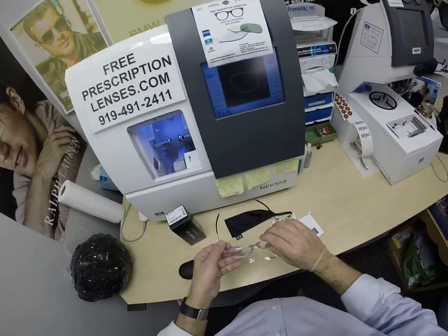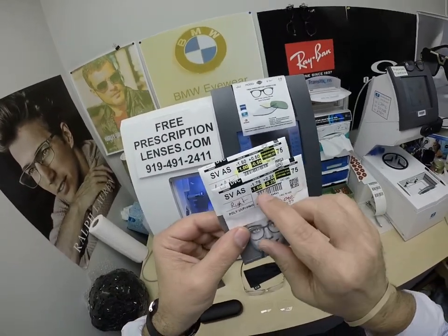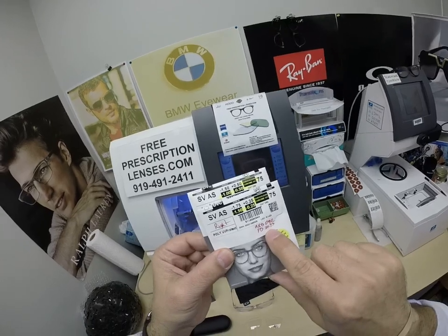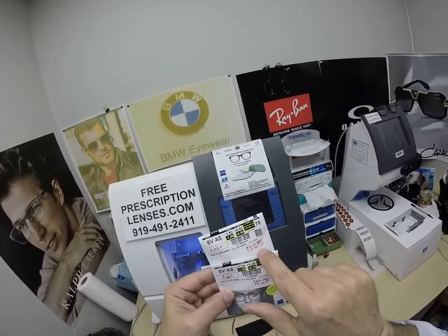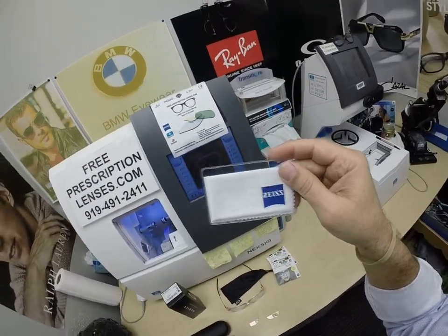Van upgraded to the Zeiss Duravision Chrome Anti-Glare. I've highlighted the prescription for the right eye: minus 1.50, minus a quarter, axis 90, with the PD on there for the right lens. Same for the left lens: minus 1.00, minus 0.50, axis 105.